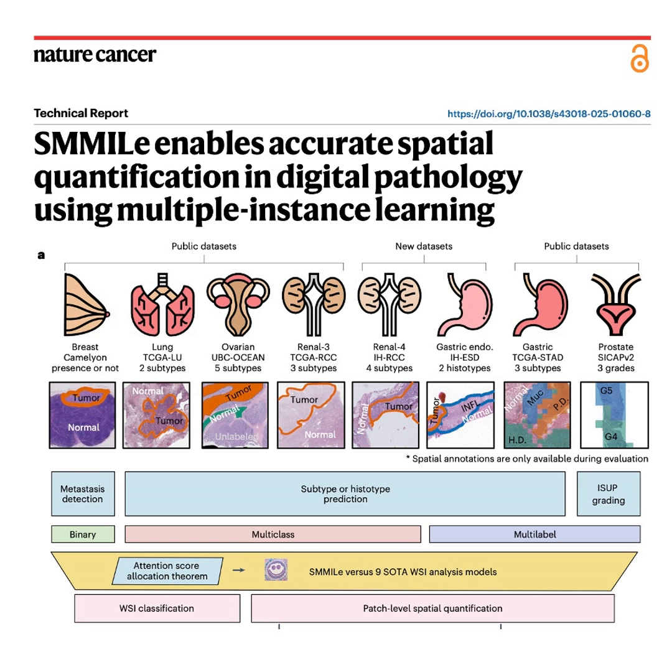I know, it sounds totally backwards until you remember IML's fatal flaw. The neon Waldo. Right. IML obsesses over the easy, obvious cancer cells and just stops looking. By actively identifying and then dropping the most obvious, highest-scoring instances during training, SMMILe essentially puts a blindfold over the easiest answer. That is genuinely brilliant. It's like confiscating a student's cheat sheet. Yes. You're forcing the system to say, okay, the neon Waldo is gone. I have to look harder at these shadowy, subtle cells to figure out why this image is still labeled as cancer. Yes. It actively trains the AI to recognize low discriminative features.